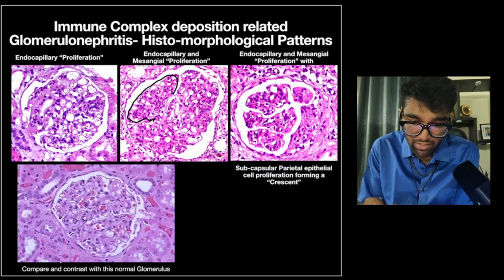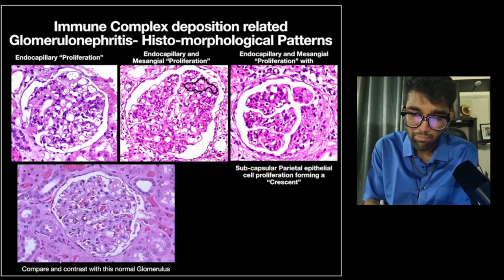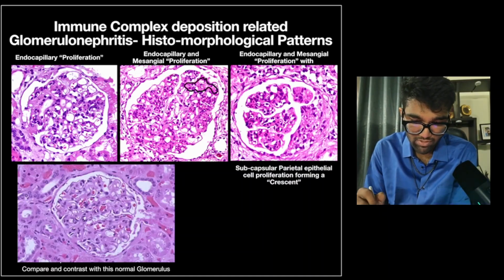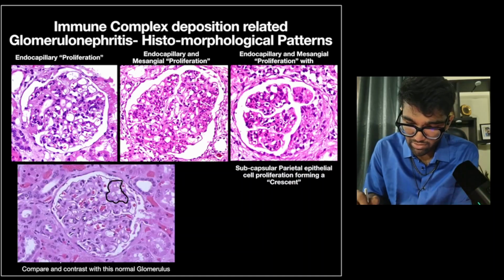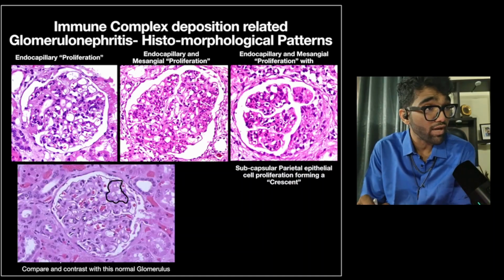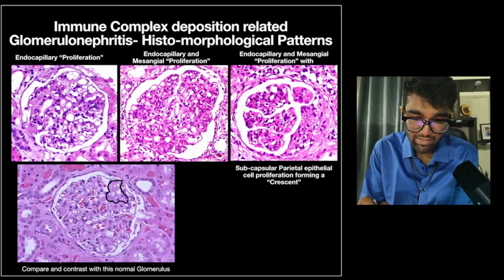But as you can see, a lot of the capillary beds are empty. Small capillaries are open, but most of the capillaries, say in this area, there are very few capillary lumina that are visible. Whereas here you find a lot of capillary lumina, and there is a significant paucity of RBCs within those capillaries. So you know that the capillaries are occluded at some point.